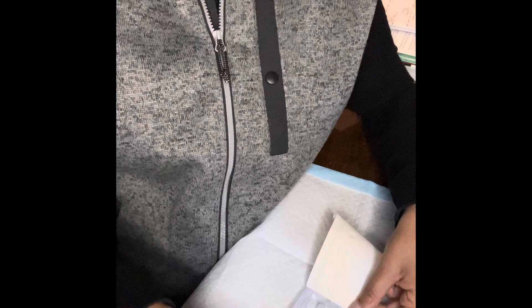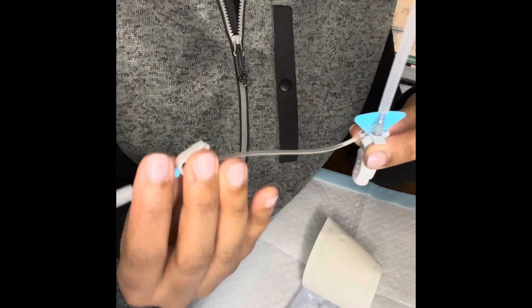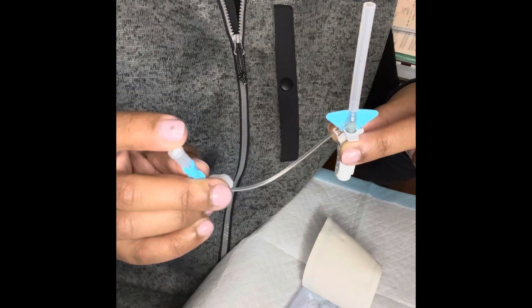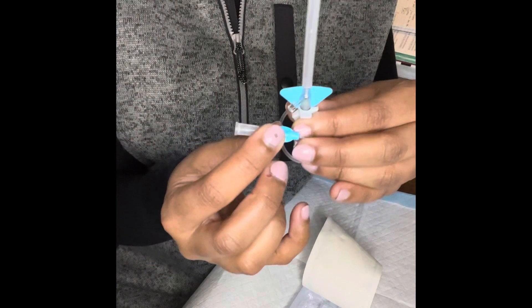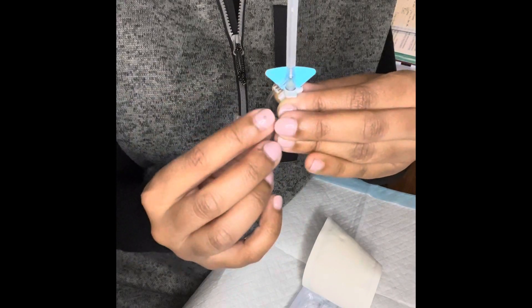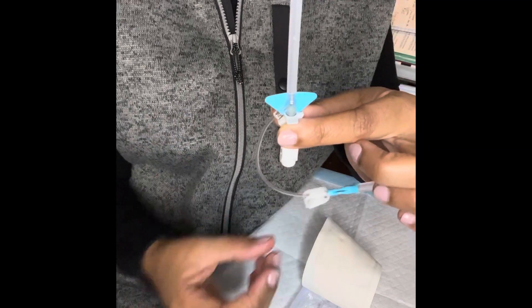After opening your packaging and examining your catheter for integrity, first thing is first — make sure your vent plug is engaged. The vent plug should always be engaged at the end of the extension set. Your vent plug is the key part of the device that maintains your closed system.